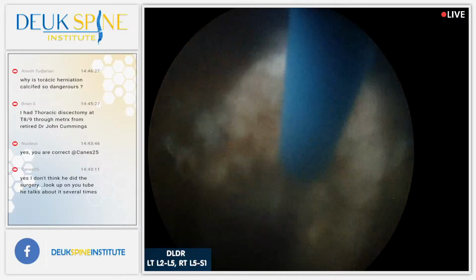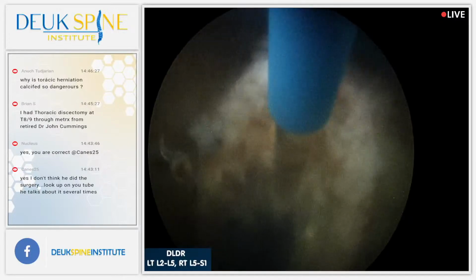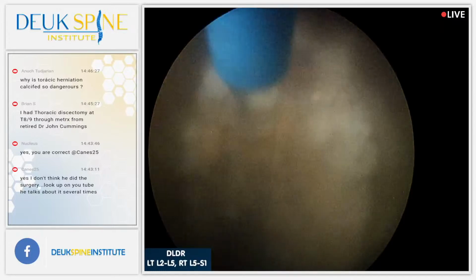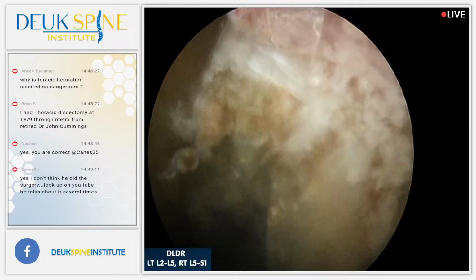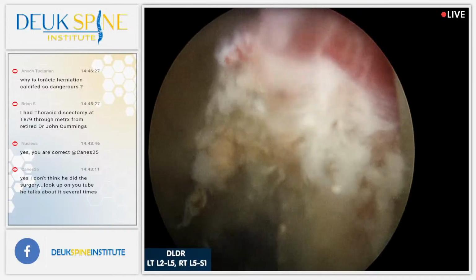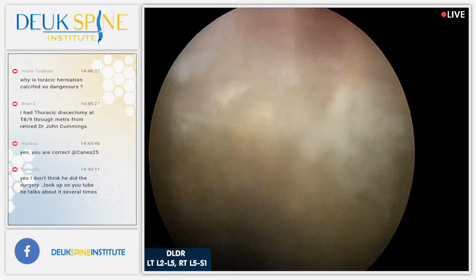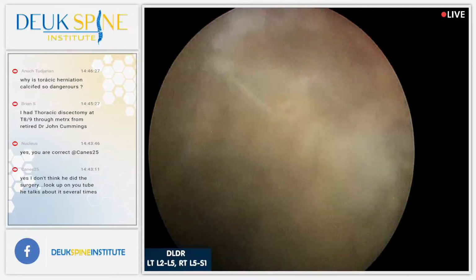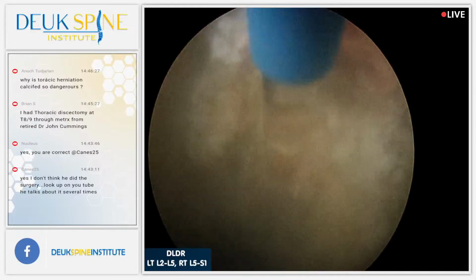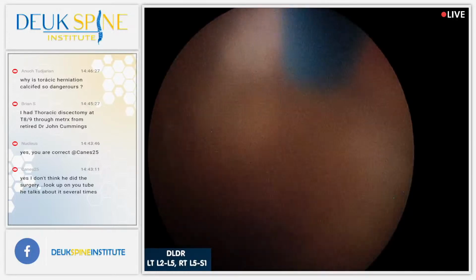So I couldn't go through the bone. The needle won't go through bone. It'll bend and just break, basically. And so you have to really finesse it. And that's the hardest part of what I do, to be honest with you, is finessing that needle. That needle finessing technique is everything. This whole surgery depends on me getting that needle in properly. And I could tell you it's challenging. It's not easy.